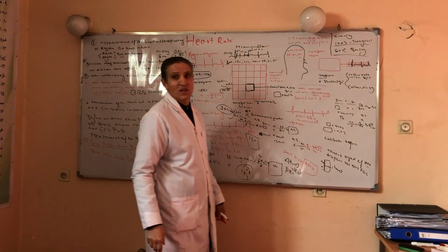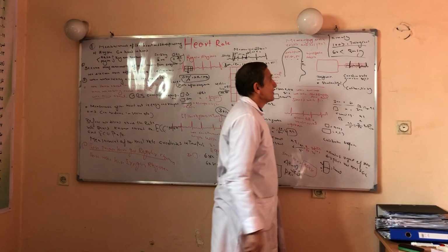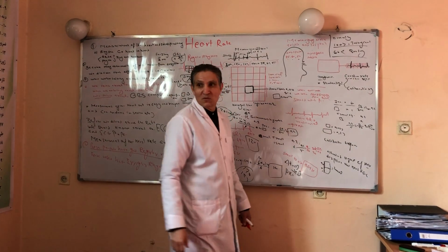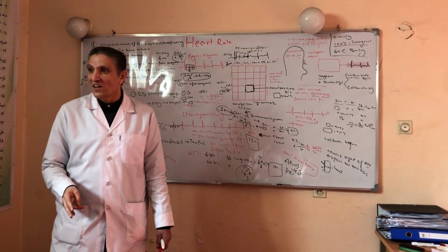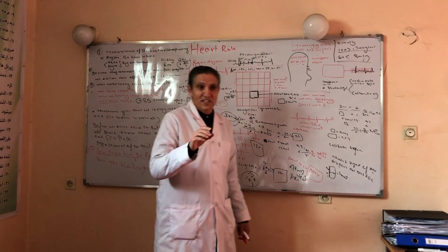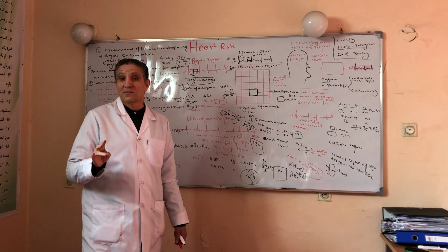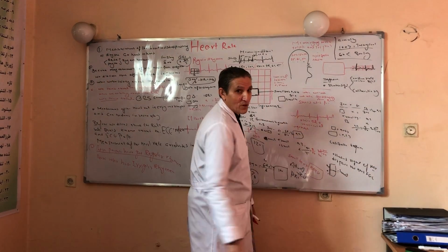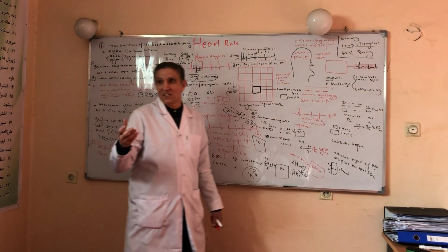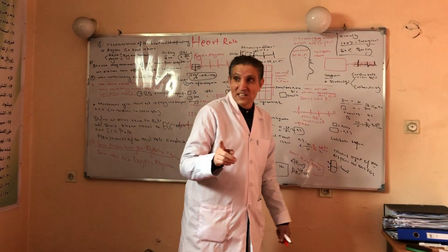Two old and classic things should not be forgotten. One is tachycardia, another is bradycardia. More than 100 beats per minute is called tachycardia. Under the topic of tachycardia, we will be discussing sinus tachycardia, atrial tachycardia, atrial flutter, atrial fibrillation, and ventricular tachycardia, ventricular fibrillation, accelerated ventricular rhythm, and Torsades de pointes. This comes under the topic of tachyarrhythmia. Under the topic of bradyarrhythmia, for example, sinus bradycardia, sick sinus syndrome, which represents sinus arrest, and 2nd degree and 3rd degree sinus node block.